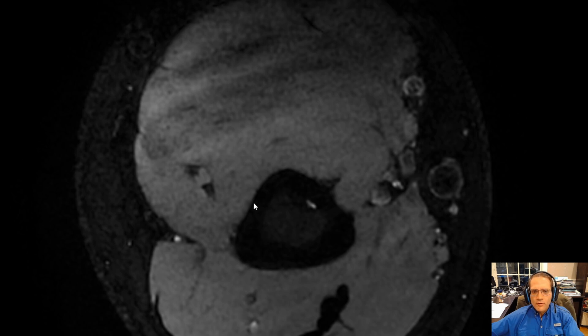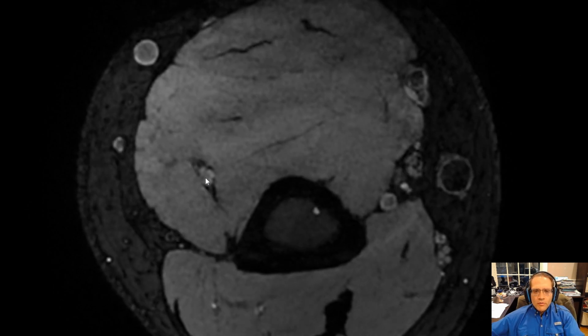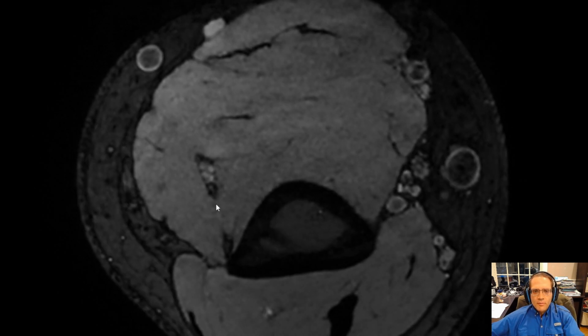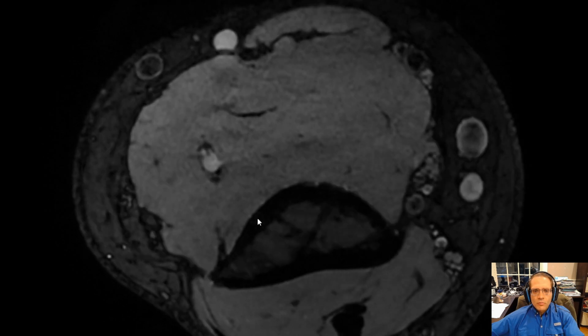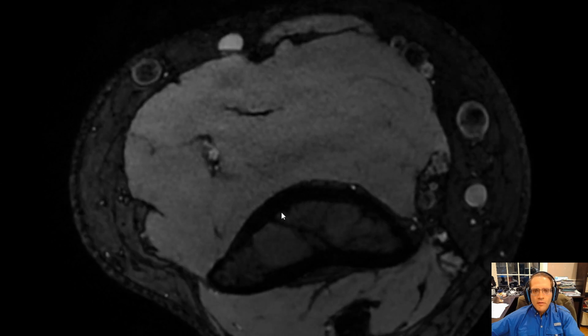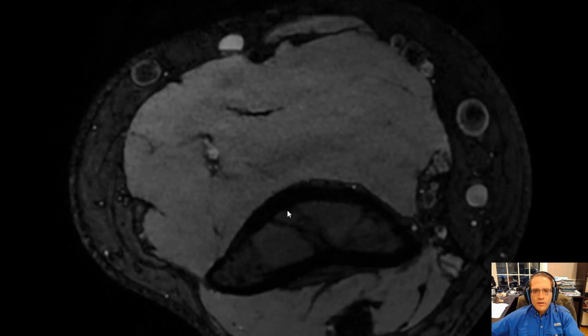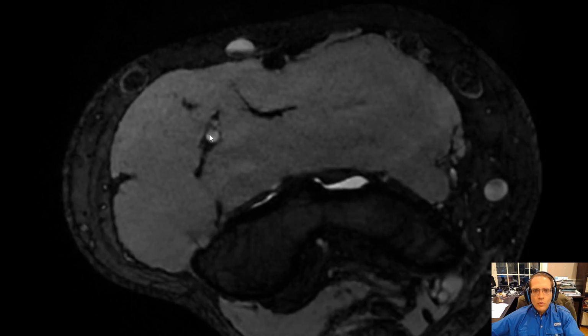Here's the humerus, here's the lateral face of the humerus, here's the radial nerve. So as we roll down, we see normal appearing radial nerve here. We can see some of the fascicular architecture of the nerve. And as we roll down, we're going to see a little target appearance here. And then boom, that's that constriction right there. And then when we get to the other side, it normalizes back up.